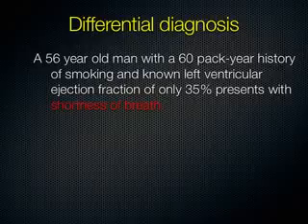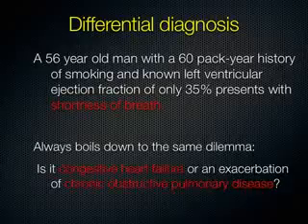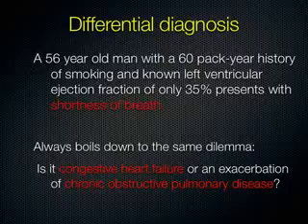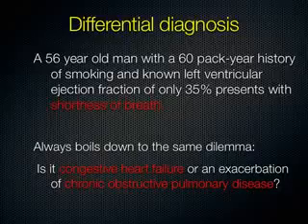And historically, we didn't have a good way of knowing, because sometimes the chest x-ray is not adequate to tell us which one it is, and sometimes it can be both, because patients are allowed to have two diseases. So sometimes we don't know how to treat these patients, and what we've done is we give them medications for the CHF, and we give them medications for the COPD, and we hope something sticks, and we hope it works. But it is very powerful now that we know how to use ultrasound to be able to focus what we do and actually give them the therapy that is directed at what the underlying problem is instead of just shotgunning the therapy.